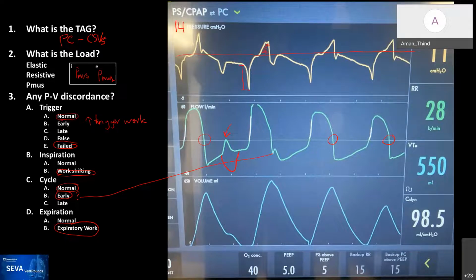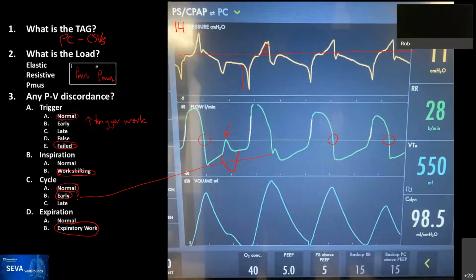I don't know if I'm not thinking correctly, but I don't think it's as simple as that, because there's always a baseline flow, and there's always an interaction with that baseline flow, the exhaled flow, and the exhalation manifold. They're all working together to give you the PEEP. So when the patient makes that inspiratory effort, the flow going through the exhalation manifold decreases, right?